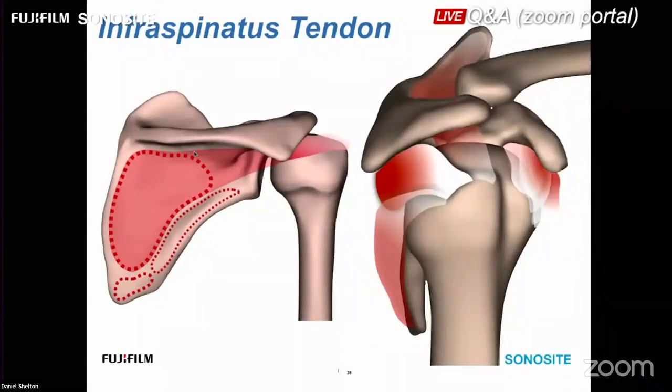Specific to infraspinatus is the origin being over this infraspinatus fossa of the scapula. A good palpation landmark, which we'll go over live, is the acromion process here posteriorly, and then the spine of the scapula. Basically, you're going to set your probe right under this posterior corner of the acromion. We have highlighted here how lateral this tendon goes when we're in a neutral position, which is what we're going to be scanning. And then we'll internally rotate the shoulder when we're scanning live with the patient's arm across their belly, and you'll see that this greater tuberosity travels very lateral.